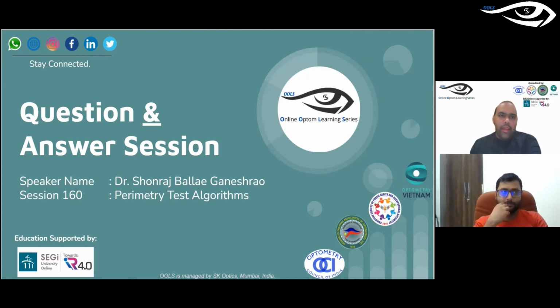Yeah, that's right. And I think usually we get to do a repeat test when the ophthalmologist in the clinical setup or an OPD setting in the hospital tells us. Most of the time, students and clinicians are confused about why we need to repeat the test. Hence I asked you this question, and I think you said it very correctly: always look for progression in terms of 3 months or 6 months data, follow up and check. Don't make a decision when you see that the field is gone in the first visit, right? Yes, absolutely.